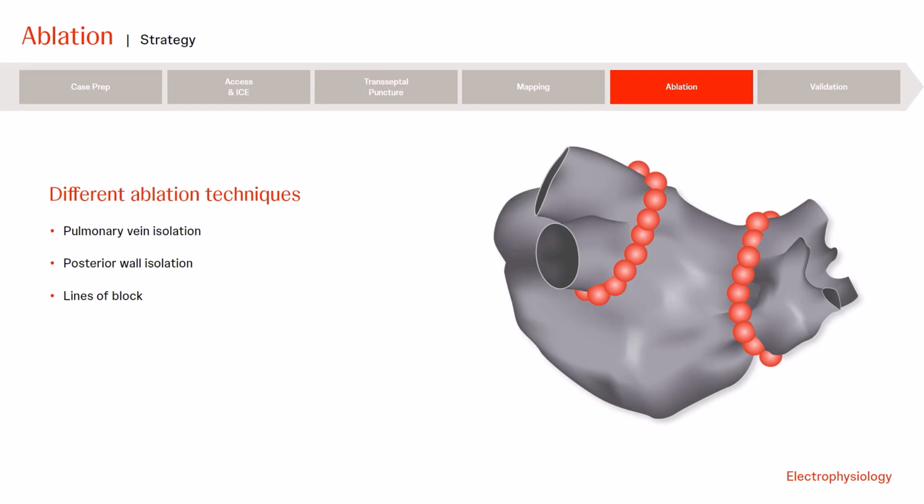The most common, pulmonary vein isolation, involves ablation to electrically isolate the pulmonary veins. Linear ablation on the posterior or anterior wall of the left atrium may also occur in order to isolate additional areas of irregular conduction related to atrial fibrillation. Learning each physician's strategy can help you estimate how long this phase may take and anticipate when to alter your anesthesia care and the end of the procedure.